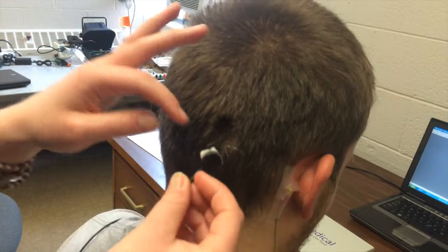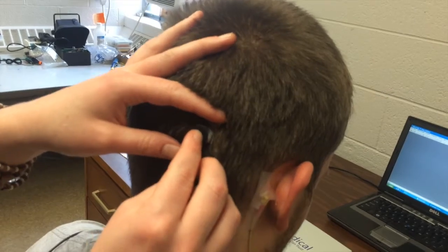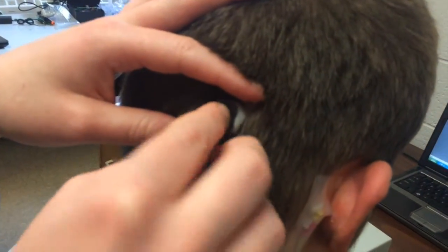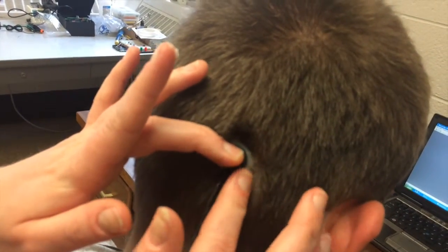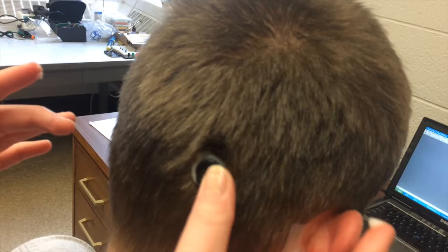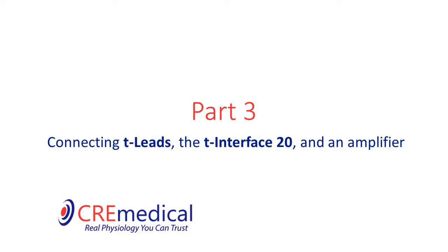Be careful not to press on the T-lead too much when you are applying it to the scalp, or else you will eject the paste. When using multiple T-leads, we usually apply labels with tape at both ends of the leads. The labels allow us to map the location of the T-leads on the head to the input channel of the T-interface 20.